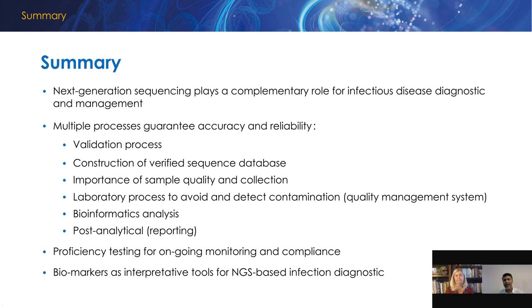It's strongly recommended that an NGS result alone is not enough to base the whole clinical management of a patient on.